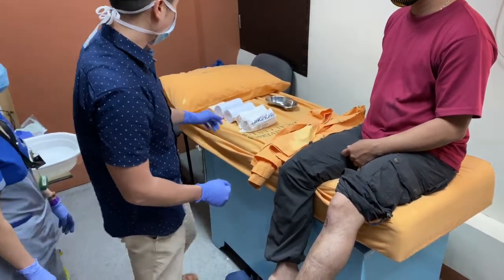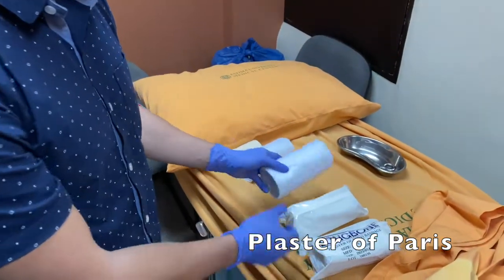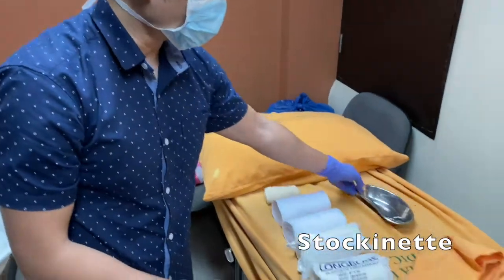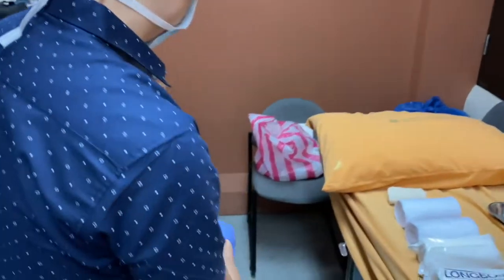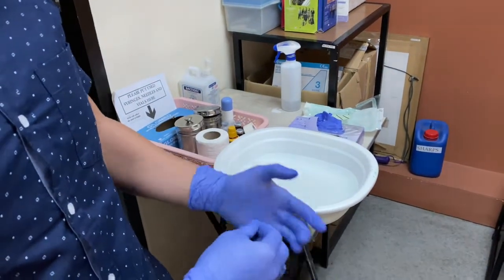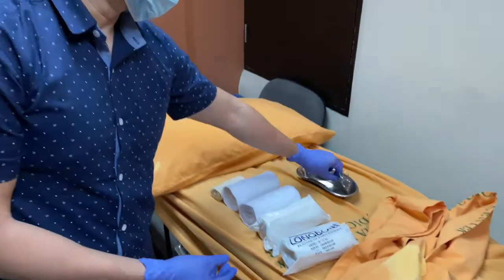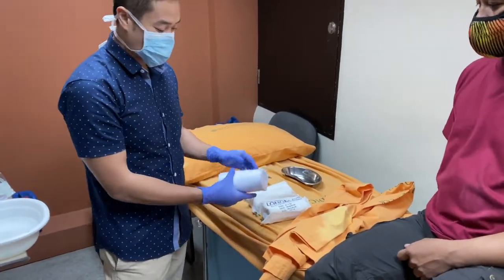We have our materials here: plaster of paris, the wadding sheet, and a stockinette. Scissors for cutting the stockinette or wadding sheet, and a basin of water. The temperature of the water should be room temperature — not too hot — because if it's too warm, the setting time will be faster.